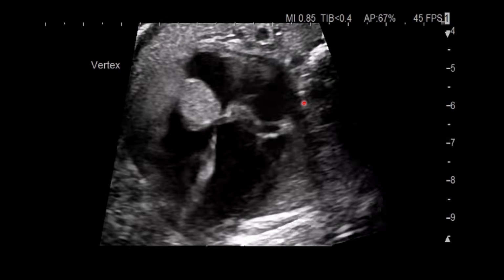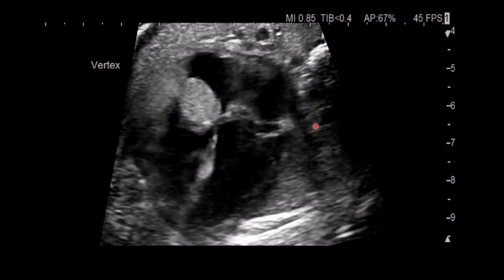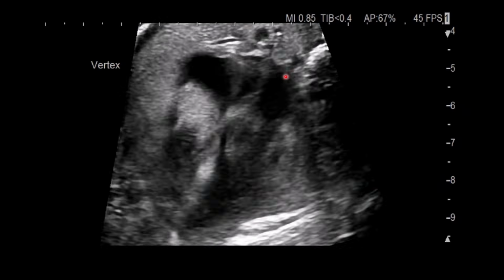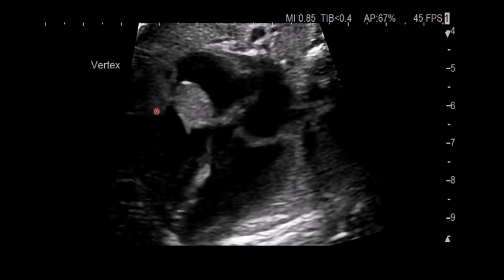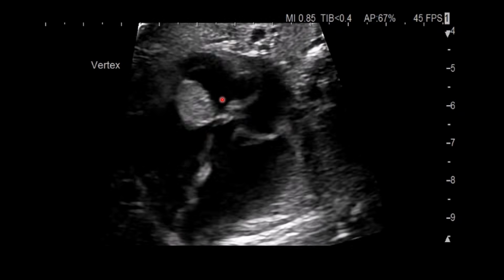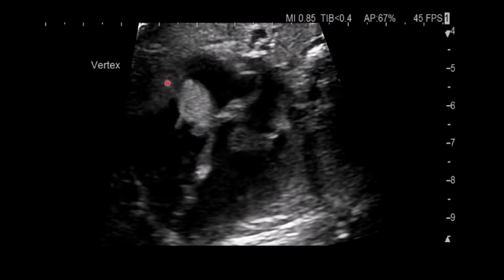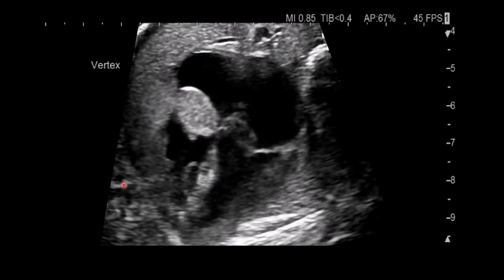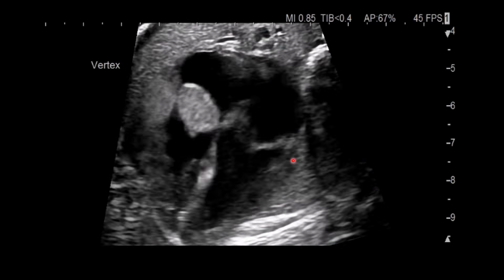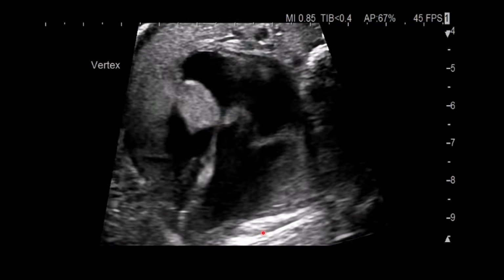Now, ventricular tachycardia is the least common and probably the most serious tachyarrhythmia. This can be associated with myocardial disease and also can be seen in long QT syndrome. This particular heart has rhabdomyomas, a large one here in the tricuspid valve annulus, partially blocking inflow, but also some tumor invading the right AV groove and most of the right ventricular free wall, and this is contributing to this ventricular tachycardia. You can see here the left ventricular free wall, part of the septum, is contracting erratically.